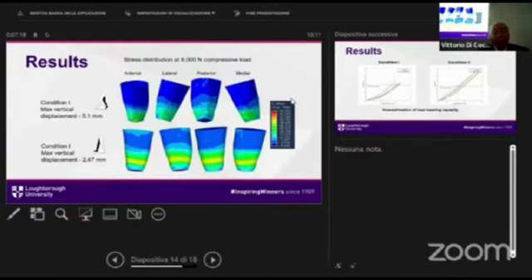These are a very short result, because I'm aware that I must finish very quickly. Short result of the simulations, which demonstrates to us that this complex type of the model, I'm showing here the socket, but we have modeled the entire system, which also incorporates all the elements of the loading device and the type how it is being applied. So it reproduces and explains the amount of the displacements and the resulting forces.